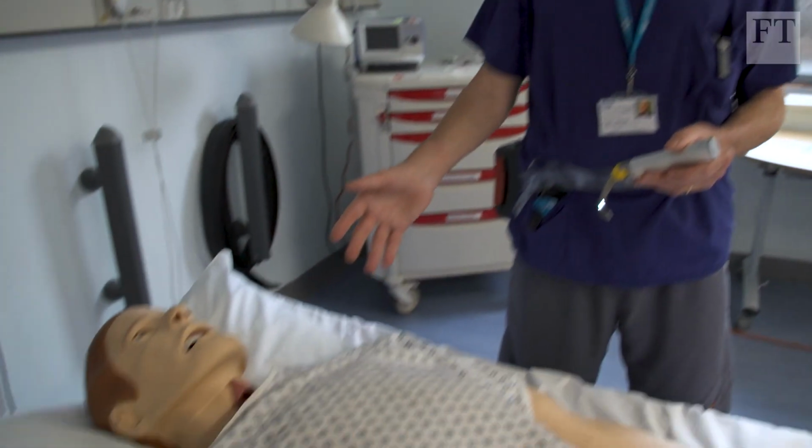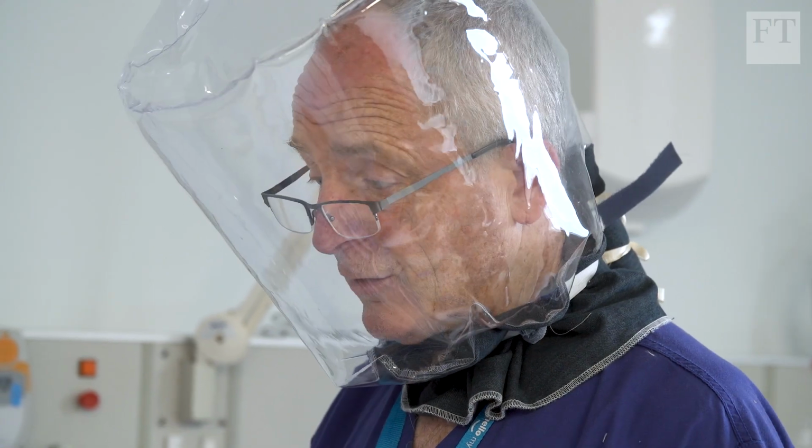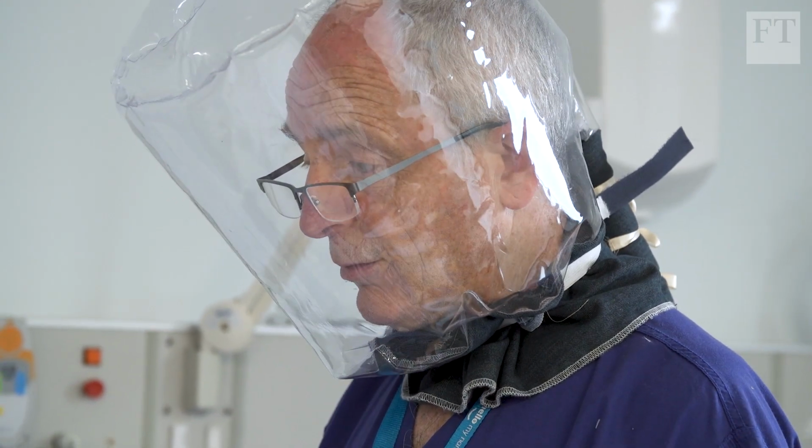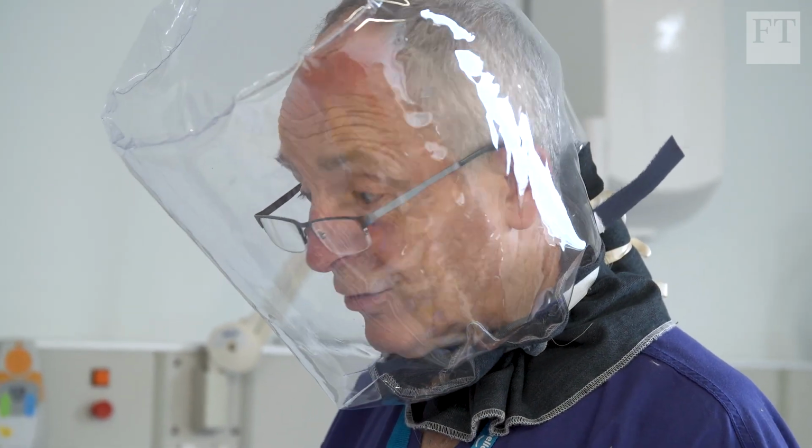For anaesthetists and ENT surgeons who are looking down people's throats all day, you're very much exposed to whatever is in the patient's airway. And at the moment, that's COVID-19. But it could be any infective agent, TB, for example.